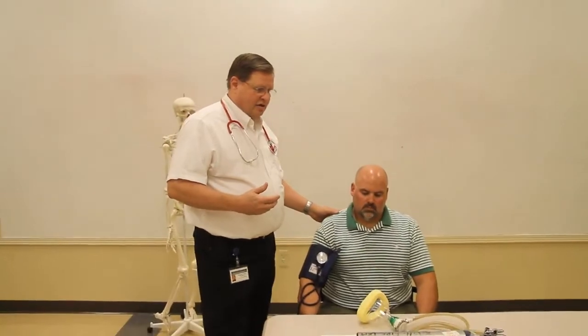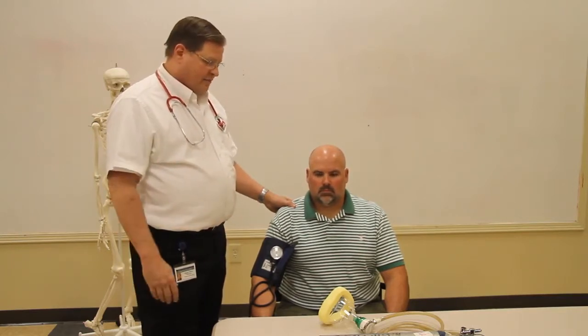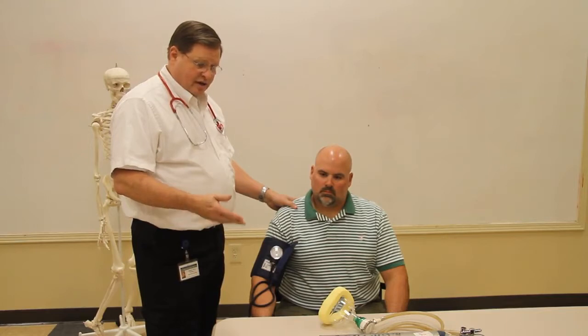The first thing that we want to do is make sure that we have BSI. The second thing is we want to find out a history about our patient, level of consciousness, if he's had anything to drink, or basically do our SAMPLE, because anytime that we give any type of drug, we need to make sure that we do the SAMPLE, and that we do vital signs also. So we introduce ourselves, we ask for permission to treat, and then we ask a SAMPLE history.